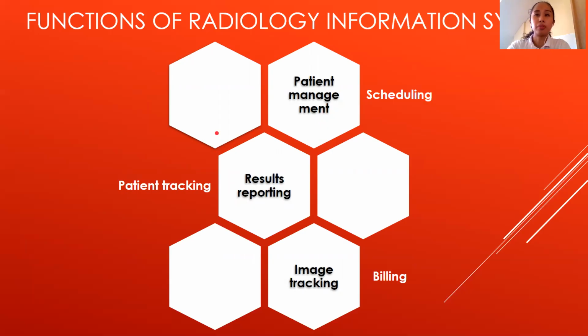Your radiology information system and cardiology information system, they not only just store the images, but they also store the interpretations of your results, diba? Pating interpretation ng radiology. So, radiologists or sonographies. So, kung magkakahiwalay, so if it's all separated, it's not very well organized. Image tracking, billing, patient tracking.